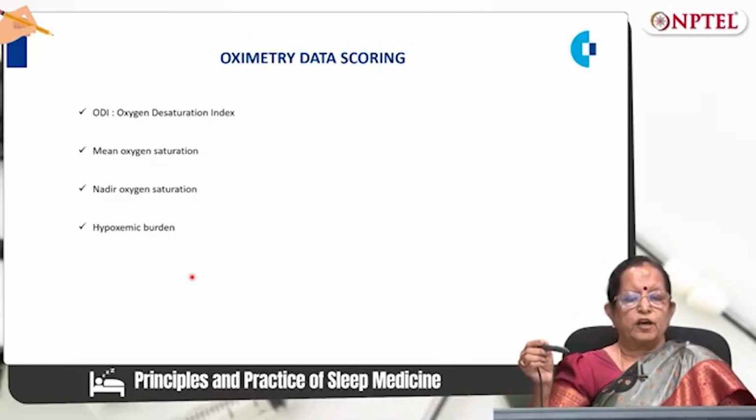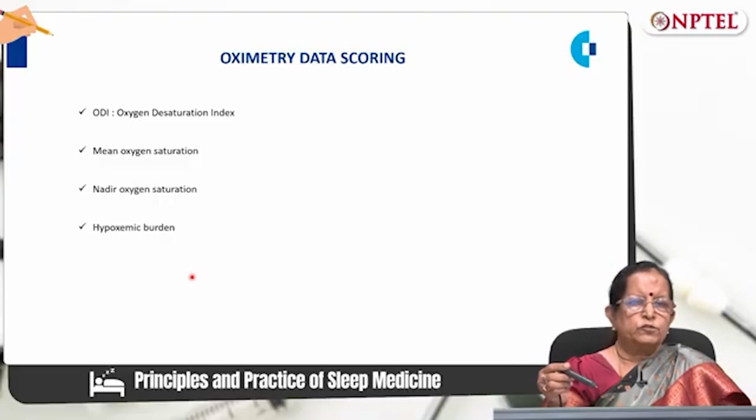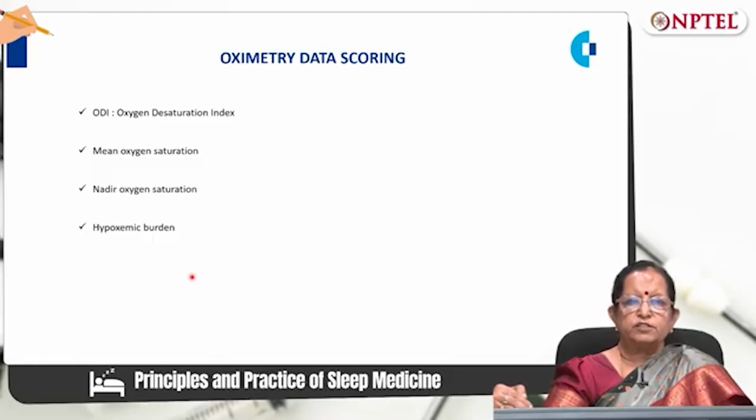Okay. Then coming to the oximetry data. What are the things we are going to score? Oxygen desaturation index, mean oxygen saturation, nadir, that is the lowest oxygen saturation, and hypoxemic burden.